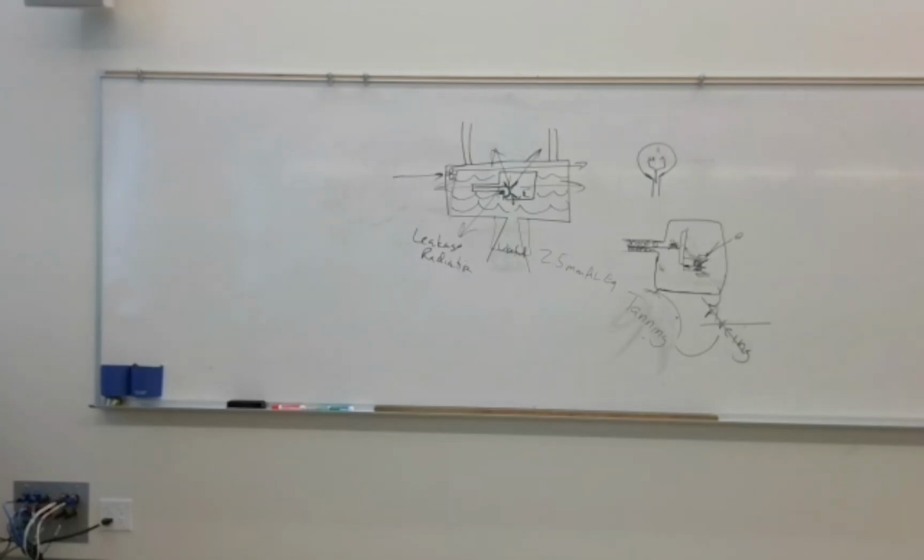So again, internal components of the cathode, the negative side: you've got two filaments. Make sure you keep the purpose of the two filaments straight. It's our source of thermionic emission. Made of tungsten, primarily. I want you to look at a couple of things that almost look like they say the same thing. Cathode. Okay. So if you look at the bottom of page 117, let's talk about thermionic emission.